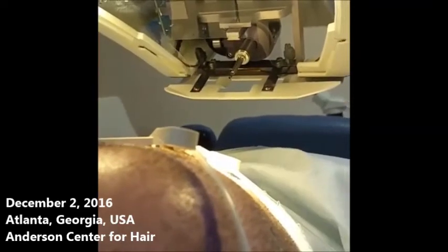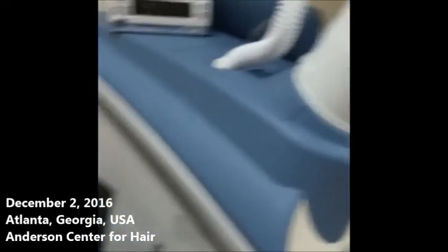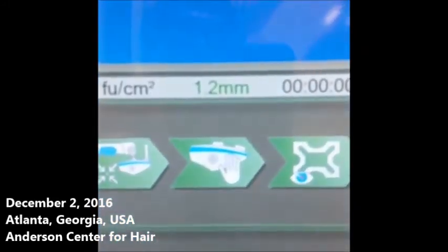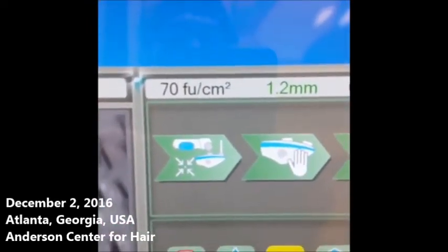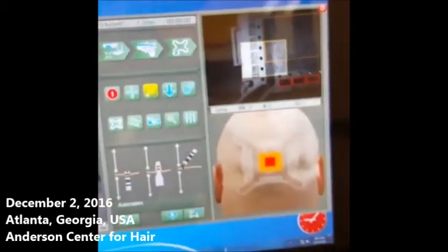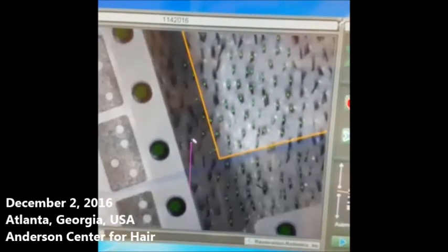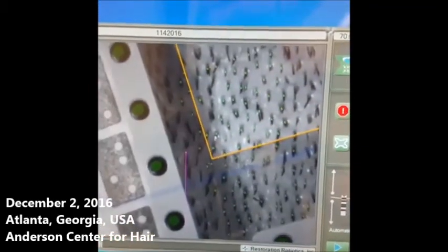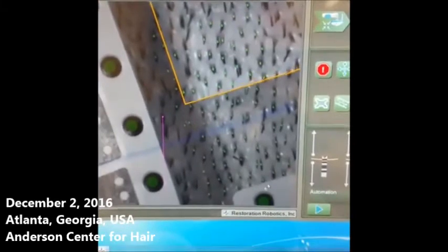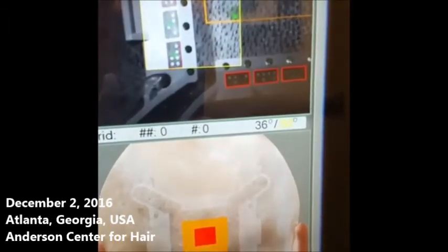Right at the end here we can see a 19-gauge, 0.9-millimeter punch. On the surgeon's operating station I want to show you the length of the hair: 1.2 millimeters. His density in this area is 70 follicular units per centimeter squared, which is a very good density. Everything in color is like a heads-up display on a pilot's helmet — these are the no-fly zones so the punch won't hit the tensioner. If we choose a hair, we can see its angle: 36 degrees off of the scalp.